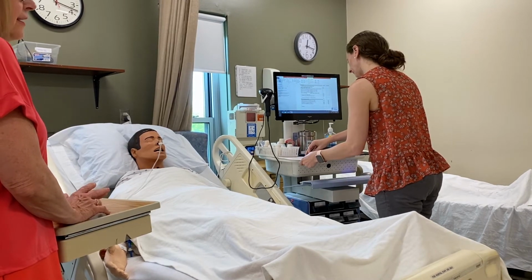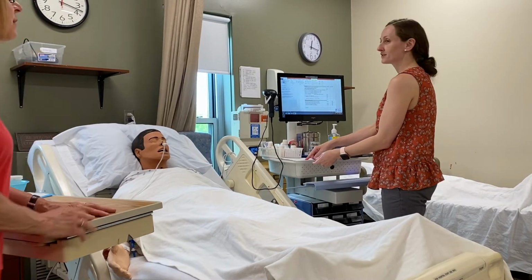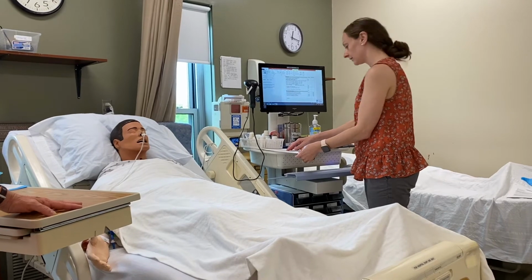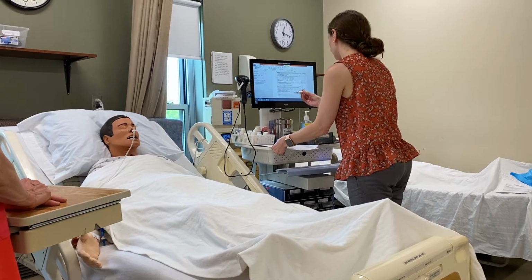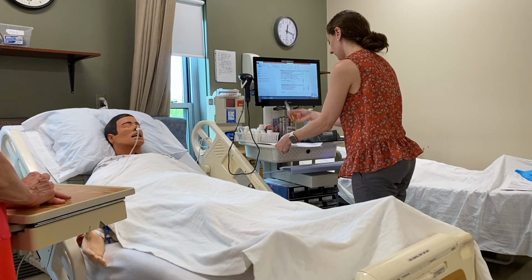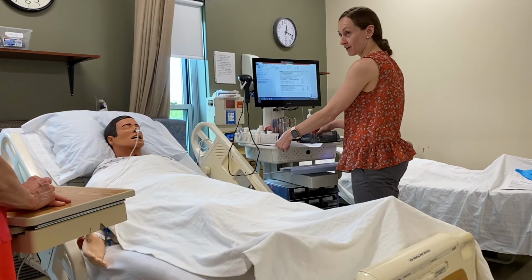Why do we give sliding scale insulin in the hospital before they eat? That covers the amount of sugar that he'll be consuming in his meal. Very good. Thank you. I'm going to be giving Lovenox, subcutaneous, 40 milligrams. That is to help prevent blood clots. Very good.